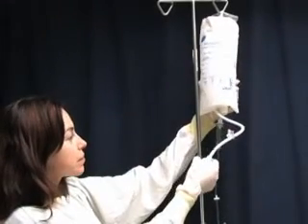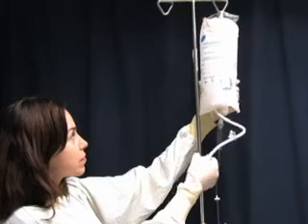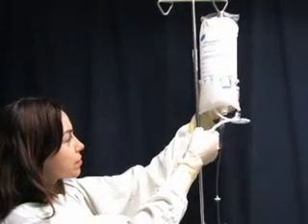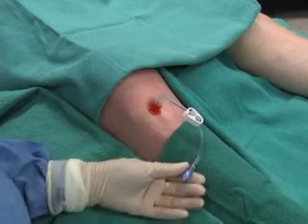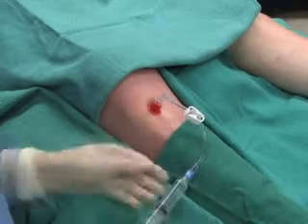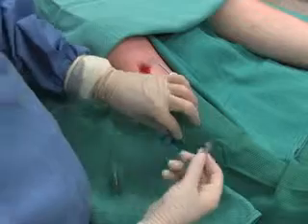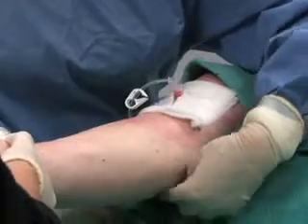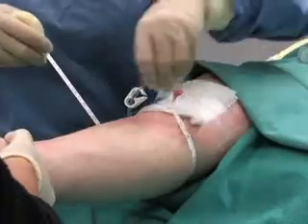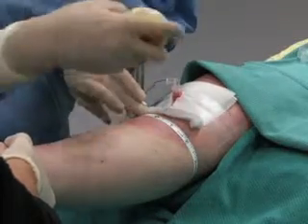A pressure bag should be used in patients requiring resuscitation, once you are certain that the needle has been correctly placed and is functioning. If the patient is conscious, anesthetize the marrow cavity by infusing 20 to 40 milligrams of 1% lidocaine before initiating fluid infusion. While infusing fluids, watch carefully for extravasation and increased calf circumference.